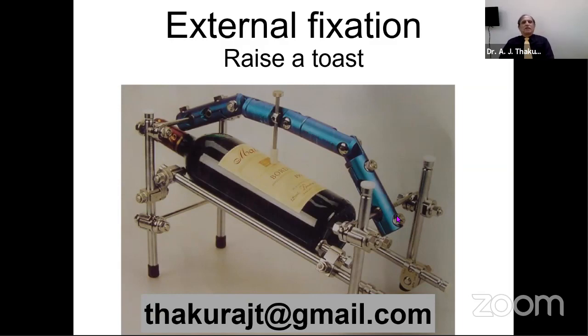Yes, sir. Go ahead. Yeah, this is really good to use tincture benzoin, because initially we don't expect any discharge from the pin site. And at that time, when the tincture benzoin is applied around the pin, and further serous discharge does not take place, then it is a very good procedure. But once the serous discharge starts, then it's no good to seal the area. Then there should be a porous dressing from where the discharge can come out.